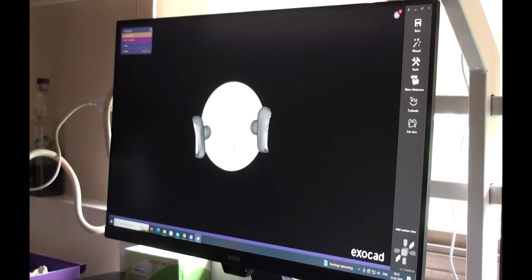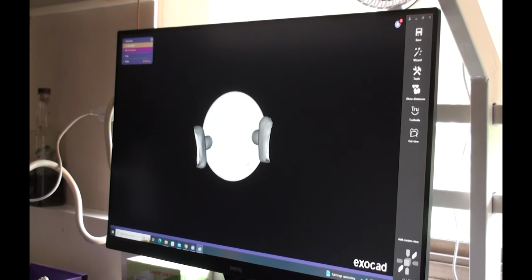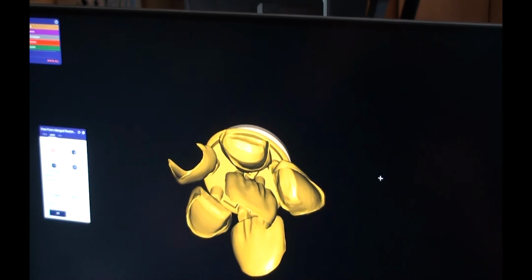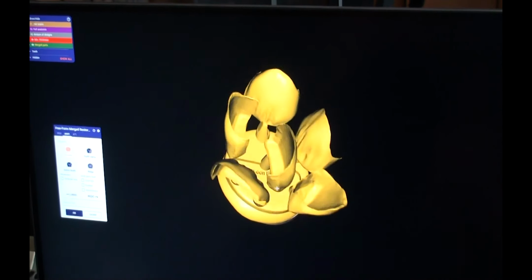Now, what if you want to add some more layered porcelain on this? So I observed Mohit do another case. Yeah, this is the case. This is having the cutback patterns that we have made for the pressing of Emax. We will be micro layering these. So we have mounted them on the ring base. Now this will be 3D printed and then it will be pressed in the lithium disilicate material.